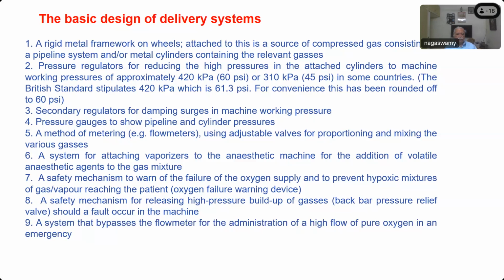And a system that bypasses the flow meter for a high flow of pure oxygen in an emergency. What is that called? Oxygen flush, sir. Oxygen flush. Fantastic. What are all the safety features incorporated in the oxygen flush compared to the older machine?